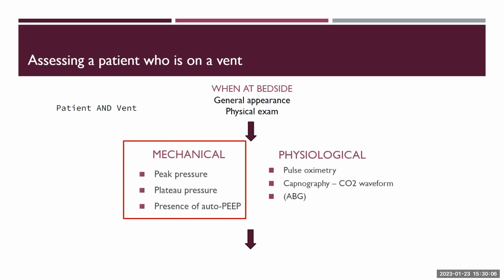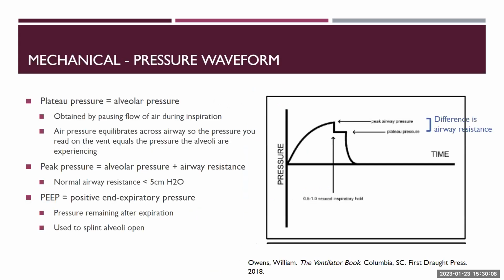So first thing we're going to focus on is the mechanical. This is a waveform that we talked about in our last talk about vents, which breaks down the mechanics of the pressure waveform.